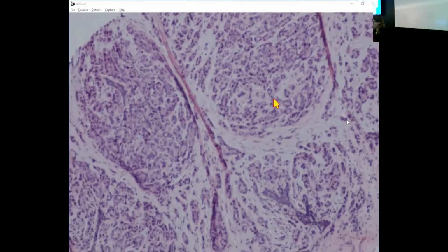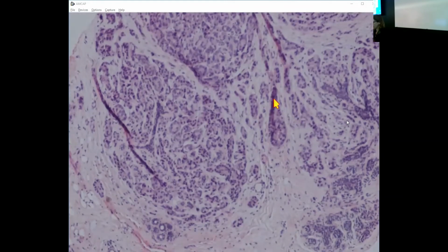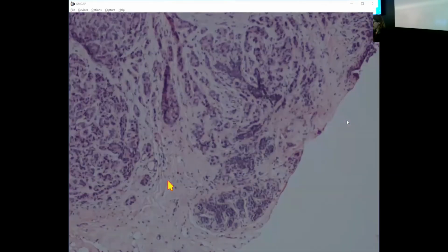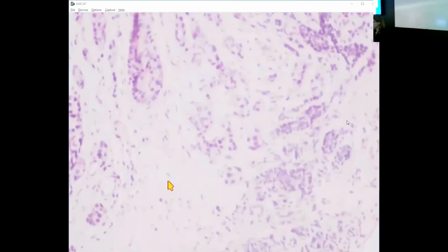I guess one thing that might be a clue, if you just had these kinds of areas, is it's a little strange to have this normal duct in the middle, these normal ducts with these small glands around. That seems a little unusual to me. And then you start saying, oh wait, actually, this is pretty atypical looking. Hang on, sorry, you need this condenser.